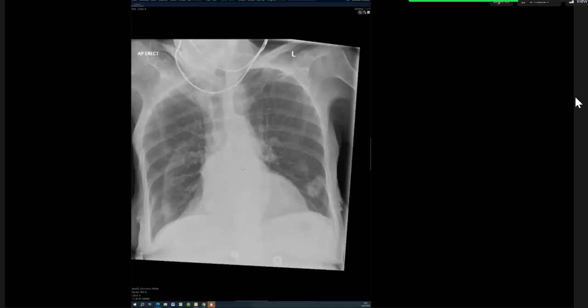We do plain chests, only chests, when it's just a nodule, like the next one. If it was just a nodule, it could have been, in many cases, an overcall. Those are the ones we do CT chests for, when we're trying to confirm there is something there. This one, we want to escalate, so we do the whole staging CT. So that's one thing to remember. If you're suspecting something aggressive, go for a full staging CT, just to show that you are concerned for very sinister pathology.